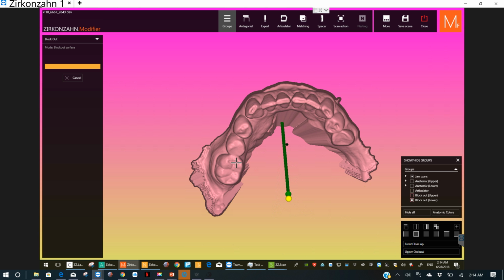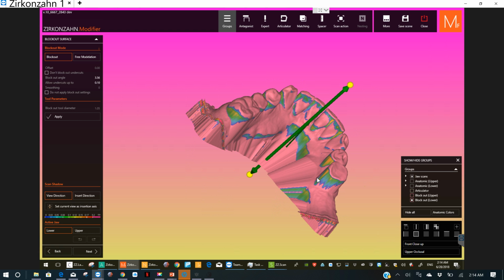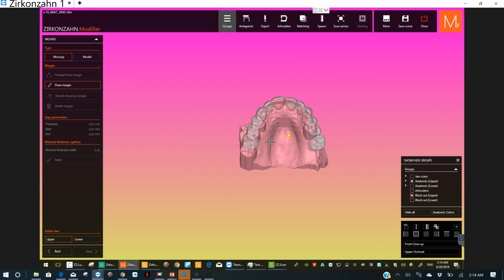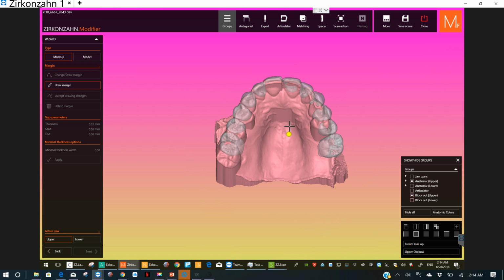All right, so there's our blocked out lower model. So now we can go to next. And now we get to draw the margin of where we want this thing.